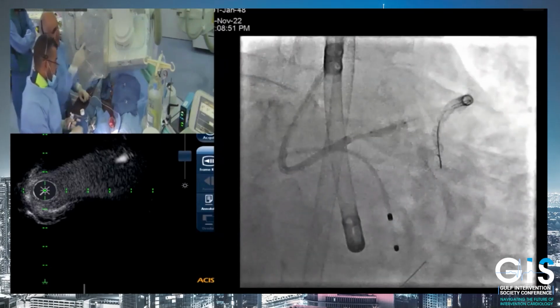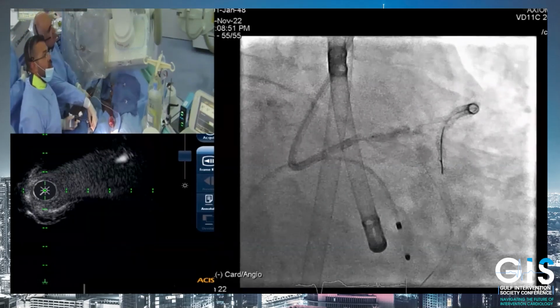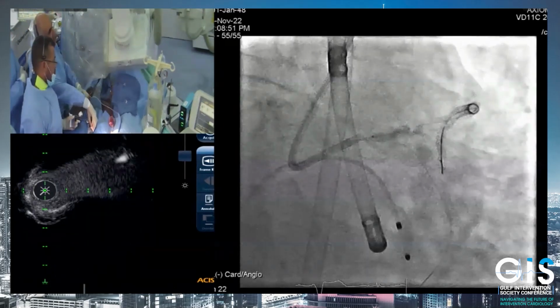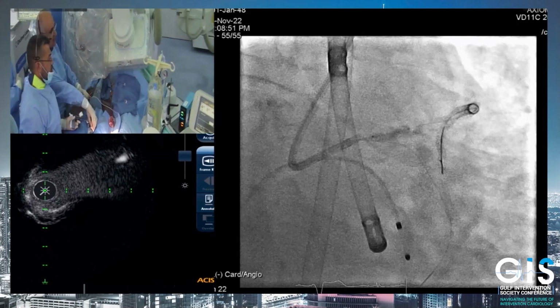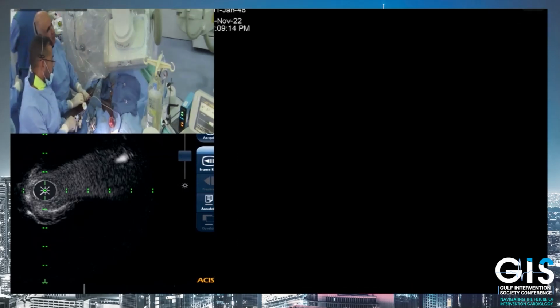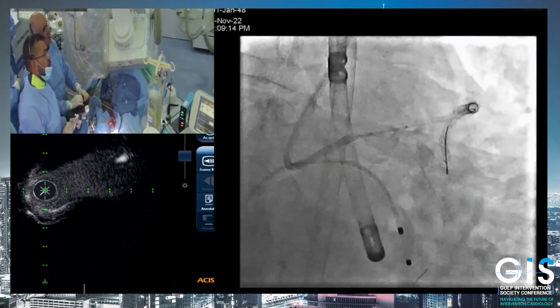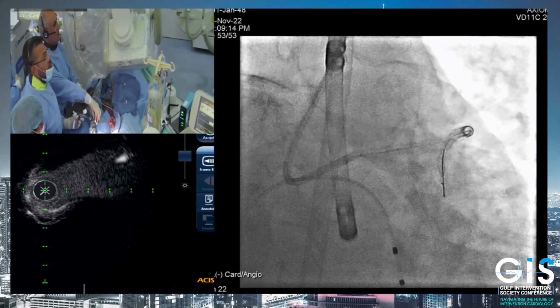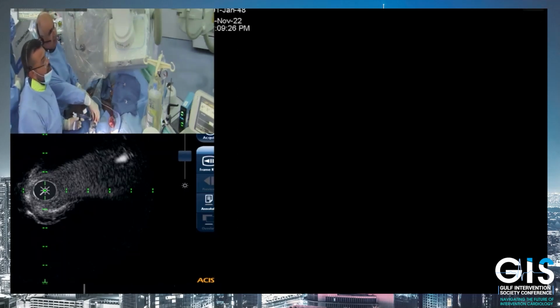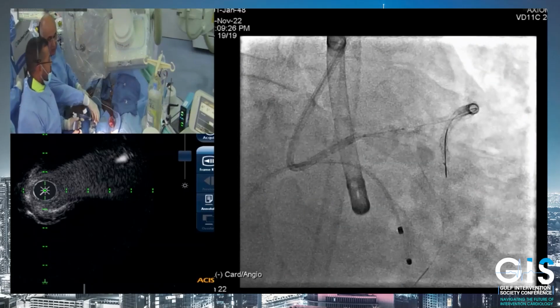Arif, can you explain the size of the balloon to the vessel? Is it 1-to-1? As I said, Dr. Adel, usually it is 1-to-1, but because I had a 3.0 distally, I'm trying to utilize this, and we have a really tight lesion. So 3.0 should be sufficient. From our experience, 3.0 is usually enough in this situation. If needed, we can still go with the 3.5. Okay, the balloon is open nicely. I'll do post-dilation. Go, please, again.